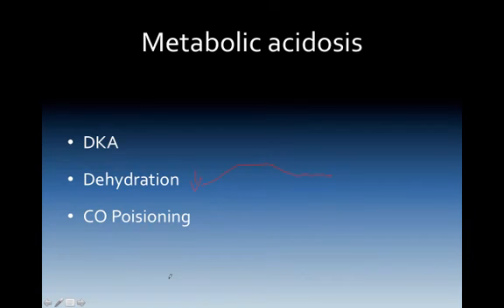In CO poisoning, if we're over 5% of CO poisoning, so a person has got dosed from a good CO open flame source. If it's over 5%, it could interfere with the amount that we see. So what this would cause us to see is low end-tidal CO2 initially, and the reason that is because the hemoglobin molecule is locked up with the CO. It can't exchange the gas as well at the cellular level.